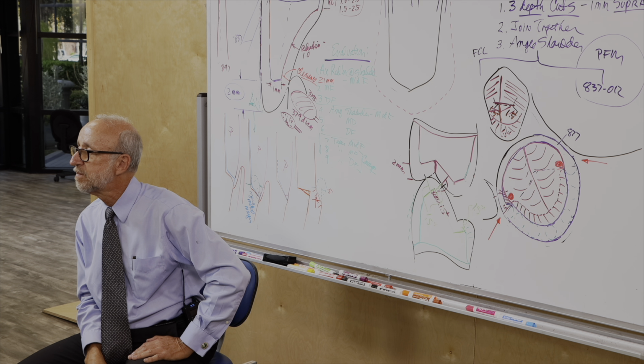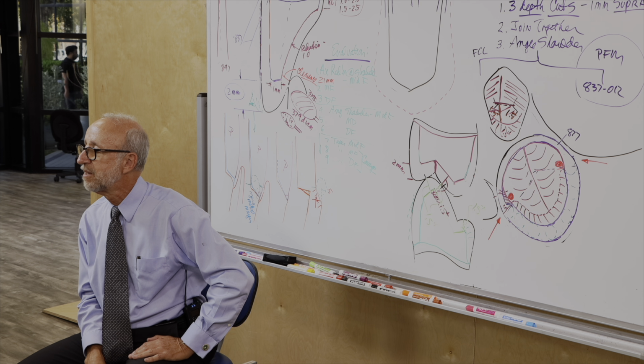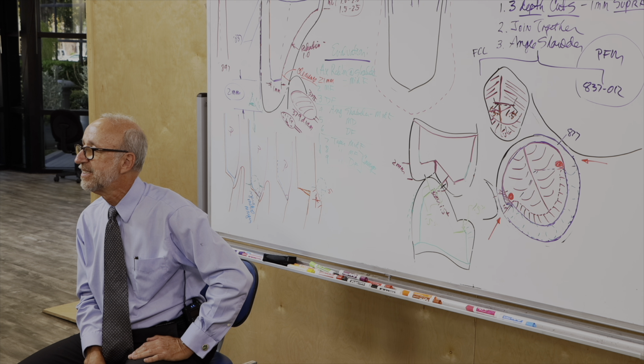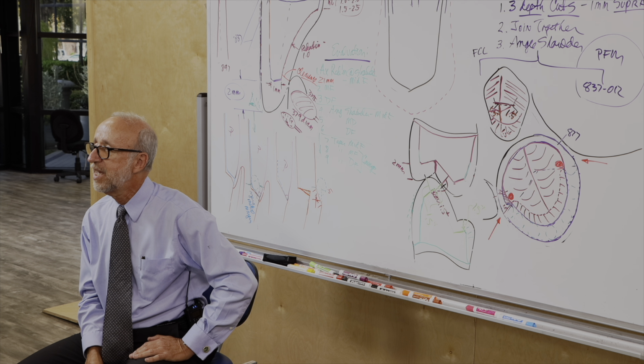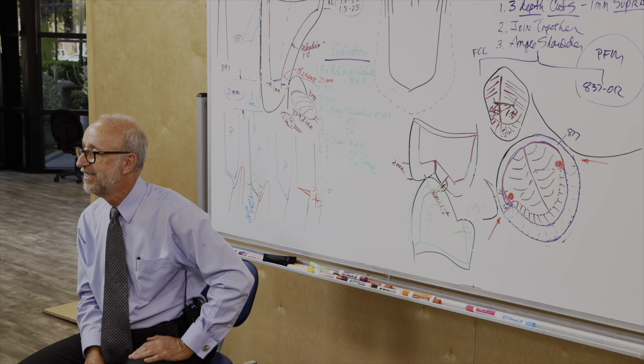So if you reduce occlusally more than 2 mm for the PFM, premolar, canine, central, for example, any tooth, any tooth. Reduce incisally or occlusally more than 2 millimeters. Yeah, is it a failure, mistake? Well, let me put it this way. Any mistake can be a failure. Okay, depends on degree. All right?